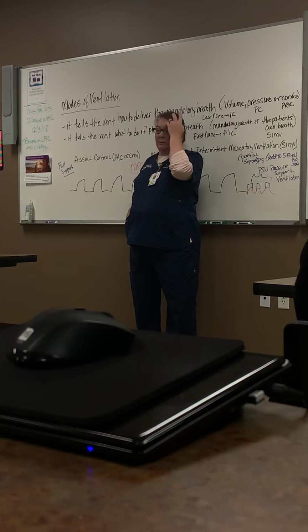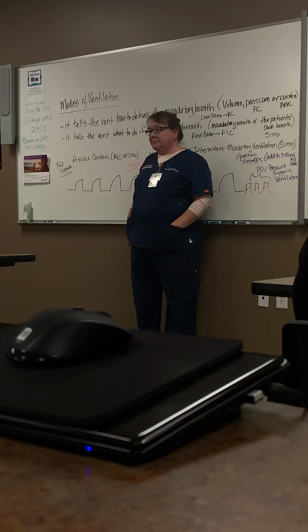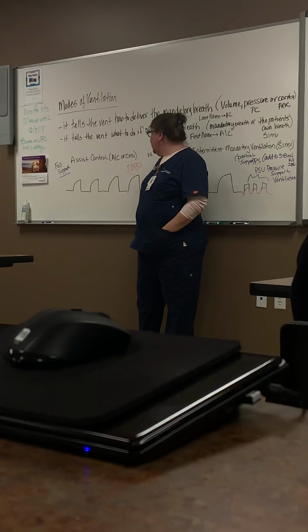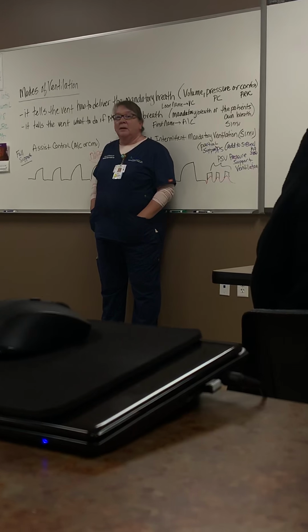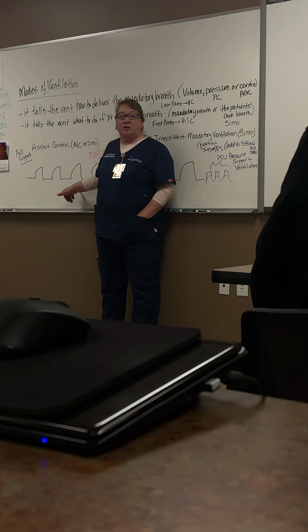Yes? Are we able to go back, like when we do our Q2 vent check, how far back can we go looking at the flats, like to see how many they're triggering? Can we go back pretty far? Oh yeah, because it's all computerized now. Okay. Yep. And it's really, all we want to know is, can my patient trigger a breath?